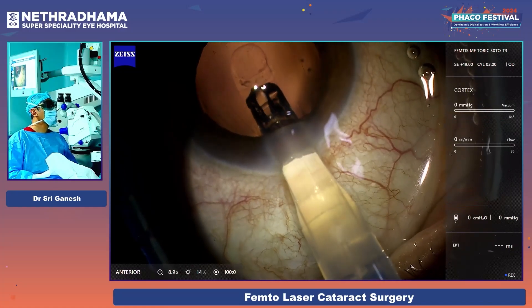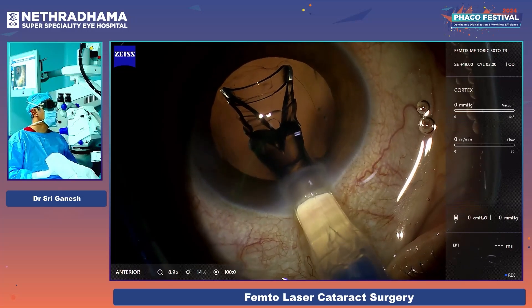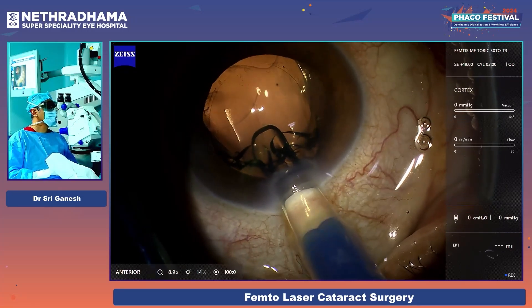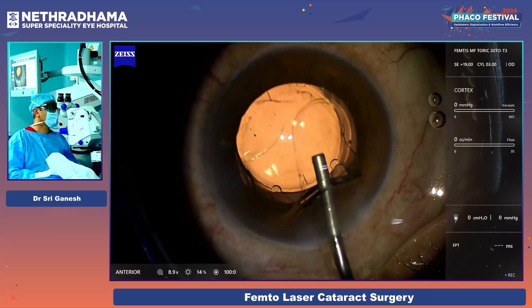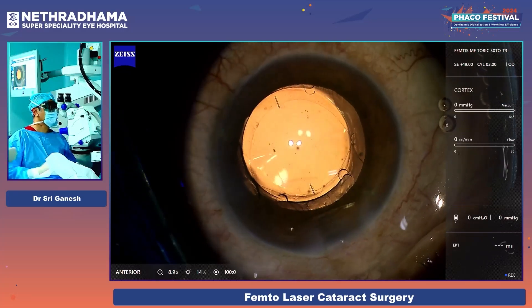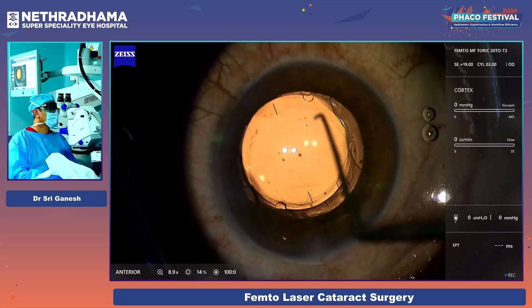Once you enclavate, it becomes difficult to clear the visco from the bag. By injecting it under BSS, there is no visco underneath the lens. So now I can put visco over the lens. I just put visco over the lens — you can see the orientation. It is oriented well at the nubs.